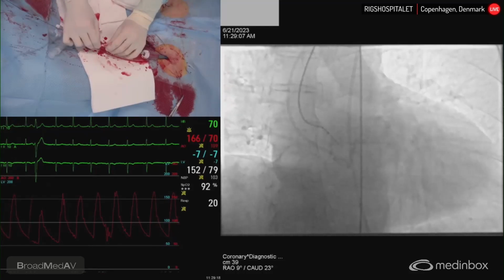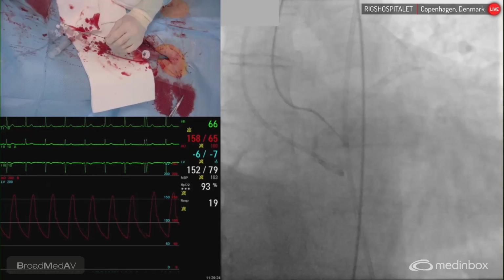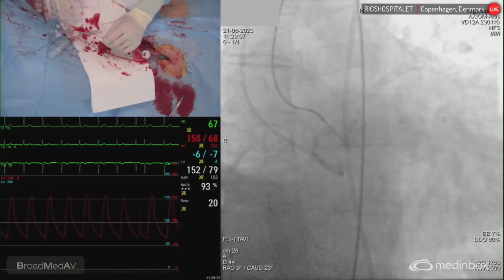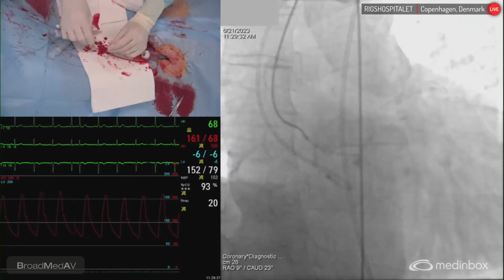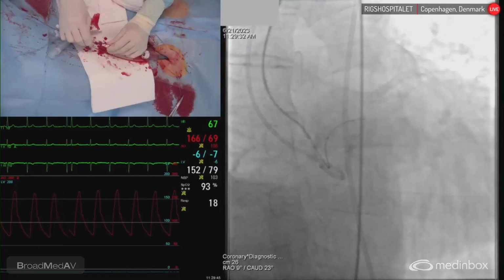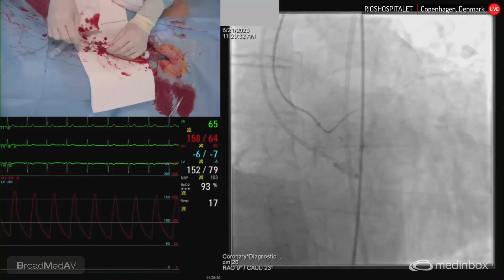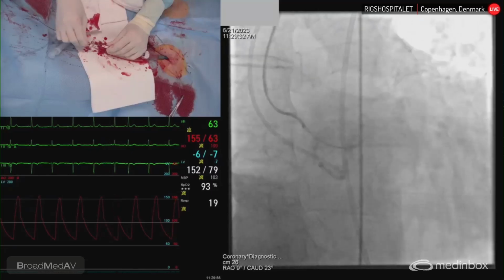You can zoom in again. That was. It's almost this part. You shouldn't make it too wet, you know. Can I have a dry one? The whole thing is super wet, to be honest. The whole wire. I like it a little bit drier, to be honest. There, just slipped. That's not the easiest in this.